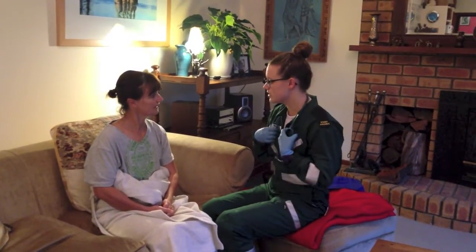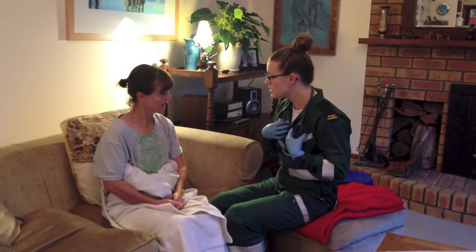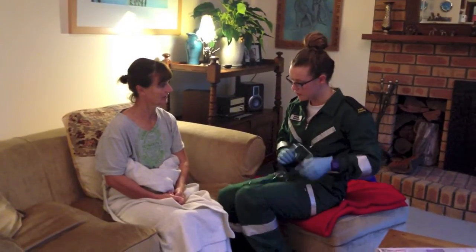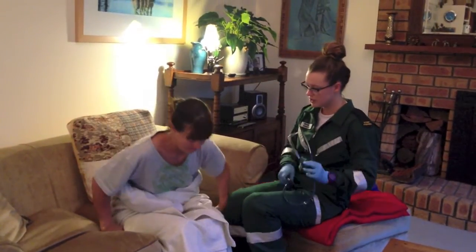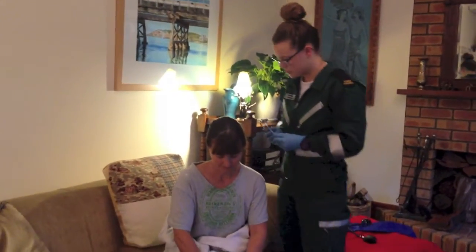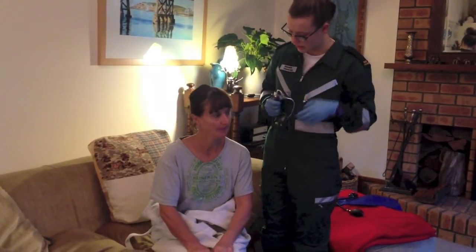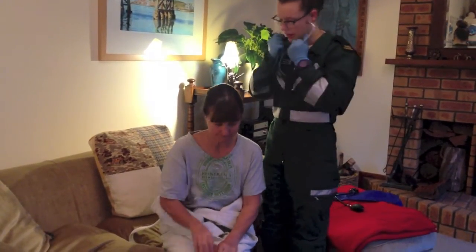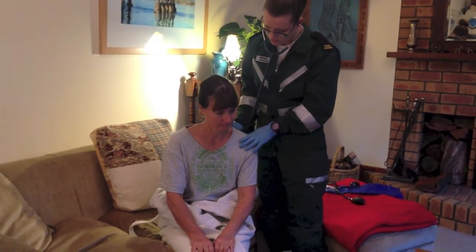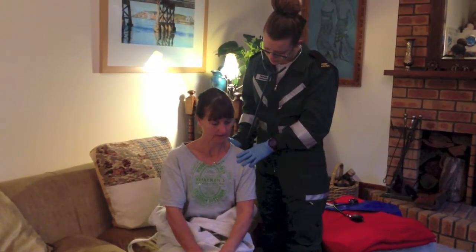Okay, so Mrs. Jones, is it okay if I do a chest auscultation today? Yes. If I listen to your chest? Yes. Yes, okay. Have you had someone do this before? Yes. Yes, okay, great. Do you just want to sit forward for me a little bit? If that's right, you can lay your hands on your knees. That's great, okay. And I'm just going to have a listen to your chest. If you just want to take a little cough to clear your throat. That's great. Okay, so I'm just going to listen to a few points on your chest. Did you want to just take a nice deep breath in through your mouth and out again? That's great. And again.